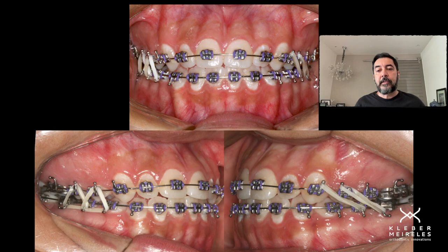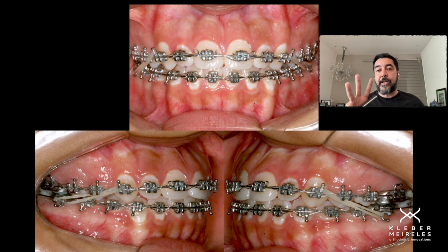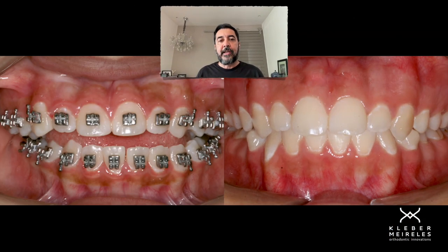The open bite is closed, but we need to keep the elastics in position for another three months with a different protocol — less time per day, but you need to keep it. After a while, we corrected the open bite and kept it closed. As you can see, this is before and after the closure of this open bite. These tips are very important.